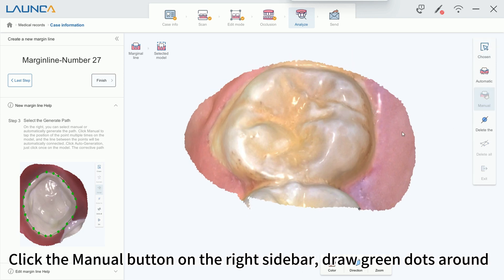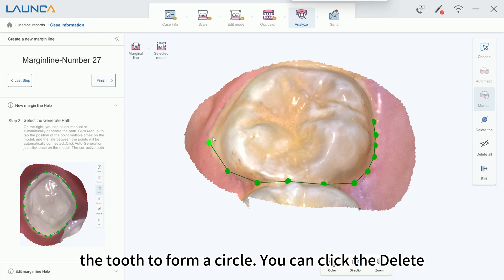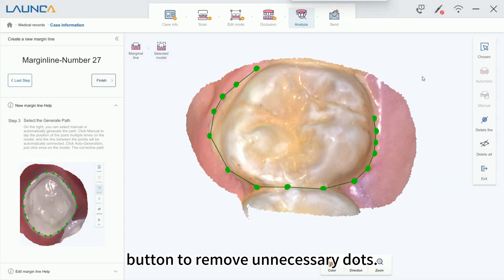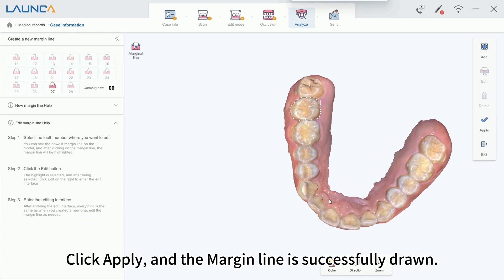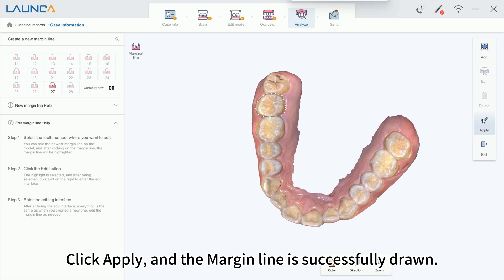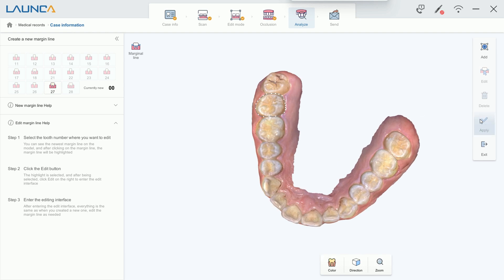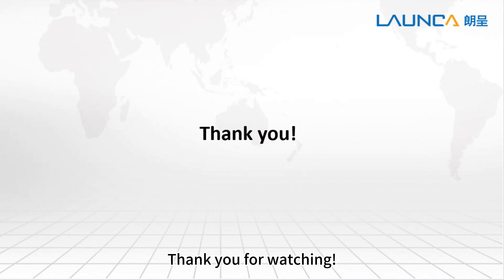Click the Manual button on the right sidebar. Draw green dots around the tooth to form a circle. You can click the Delete button to remove unnecessary dots. Click Apply, and the margin line is successfully drawn.